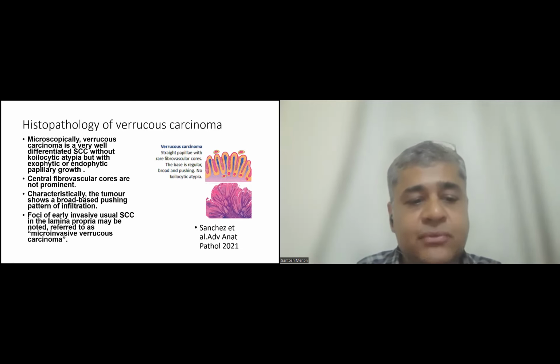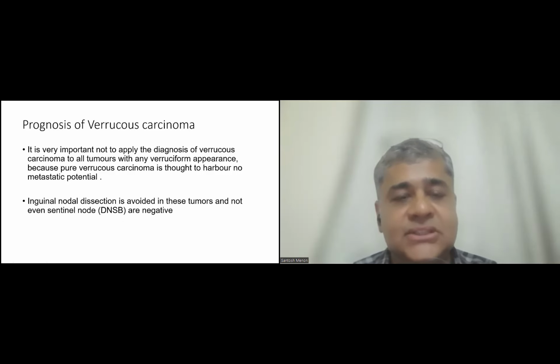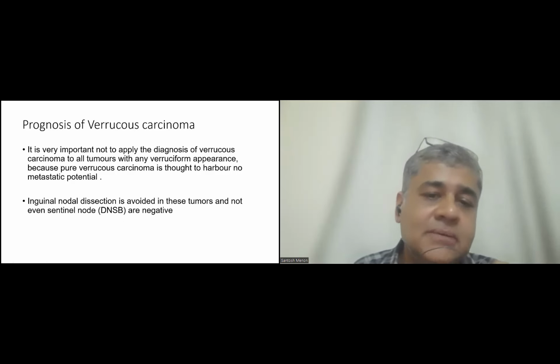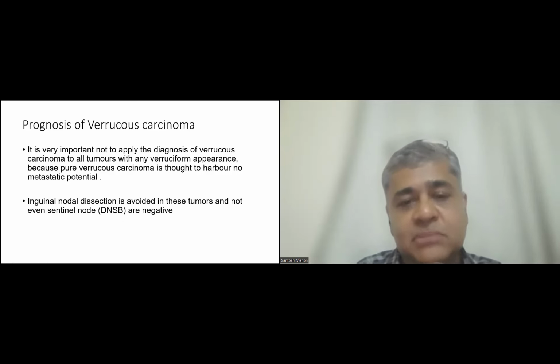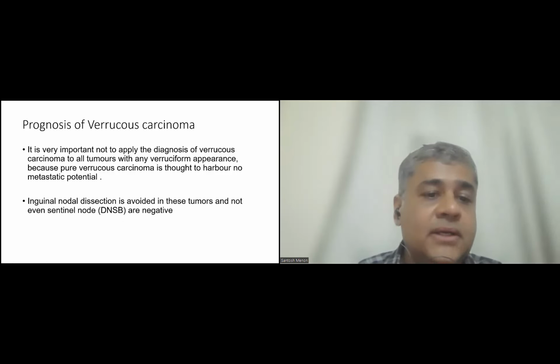The importance of recognizing these verrucous carcinomas is that these patients don't need an inguinal dissection, and they don't even need a sentinel node kind of surgical procedure, because they do not metastasize. If you have truly diagnosed a verrucous carcinoma, I know it may seem very easy on a picture, but this is sometimes one of the most difficult diagnoses we encounter in day-to-day practice when we are looking at these tumors.